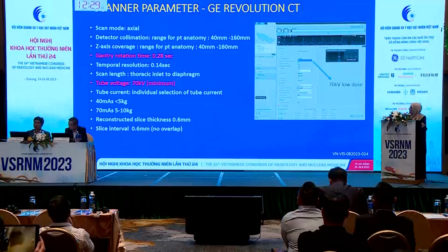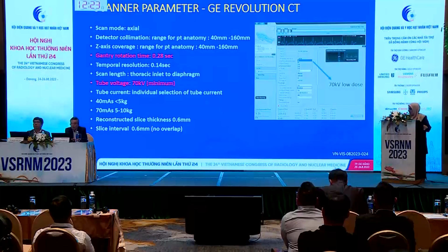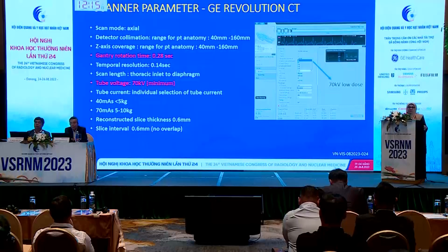Now this is just showing you the scanner parameters that we are using. Basically, the point that I want to highlight here is that we have the advantage of using a tube voltage of 70 kV, which is the minimum kV present in the market, I think, to date.